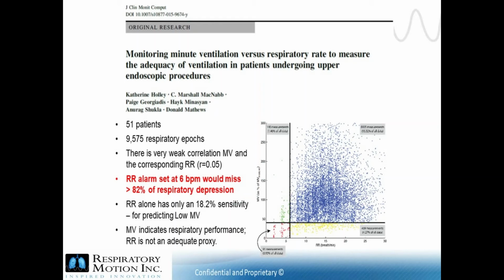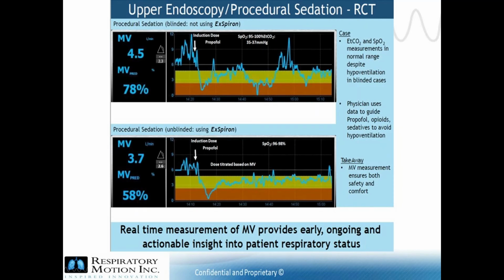Capnography was used by anesthesiologists in this study, but was often noted as erratic or unavailable. Our study suggests that ventilation monitoring could help optimize anesthesia, direct airway maneuvers, and provide real-time feedback for anesthesia care providers.